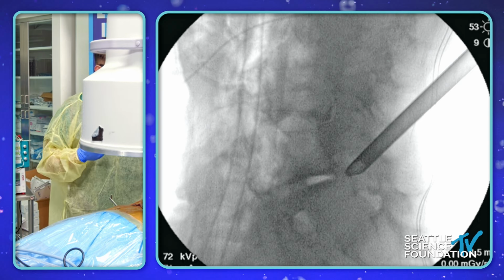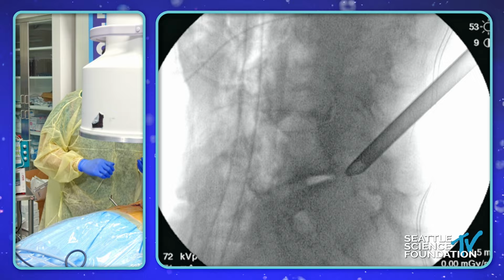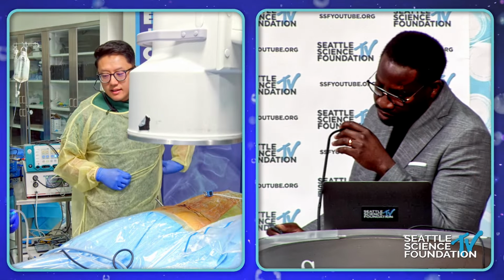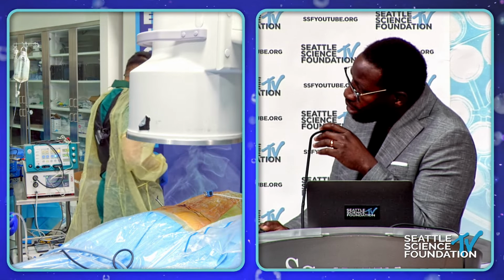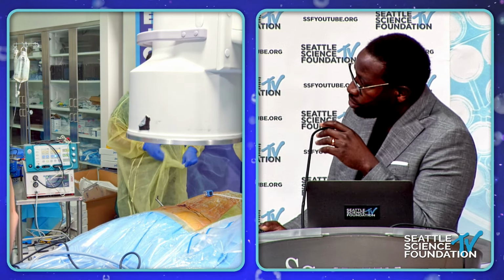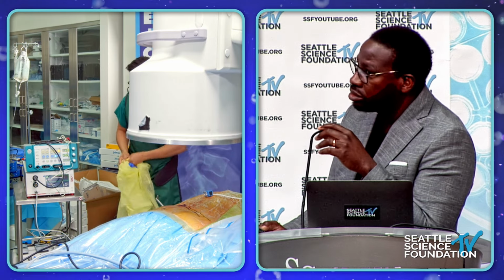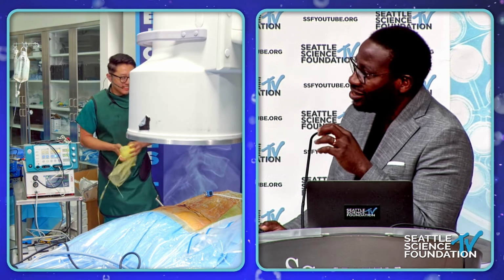So is this where I stop? Great job on that very difficult targeting approach, Meng. We're going to now transition over to Saqib, and we're going to do targeting for the interlaminar approach, which will be at the L5-S1 level. Saqib, don't take that transforaminal port out. We're going to need that one.